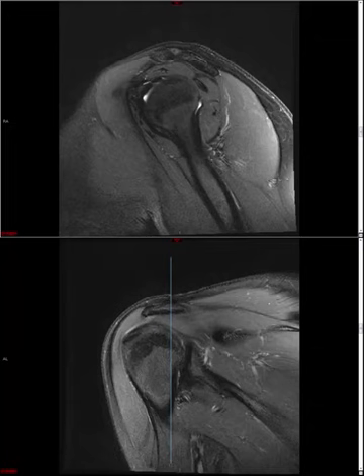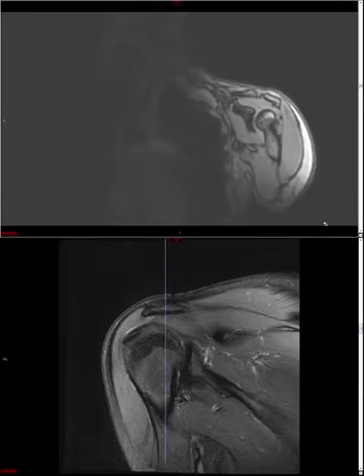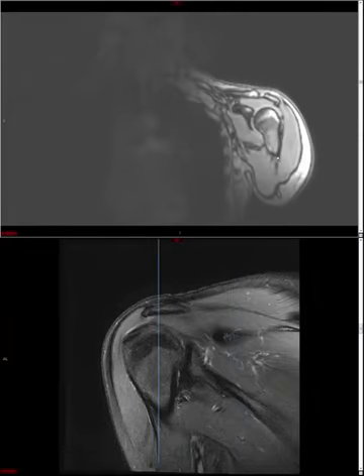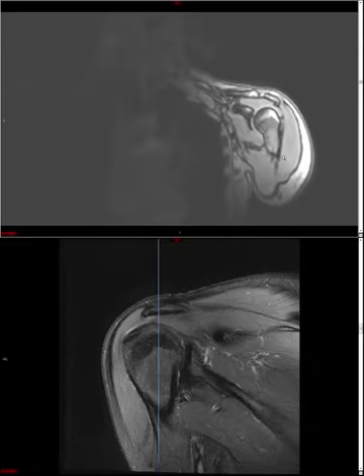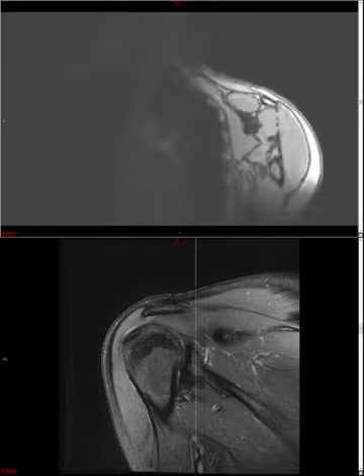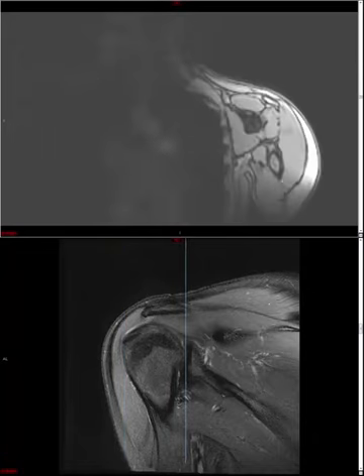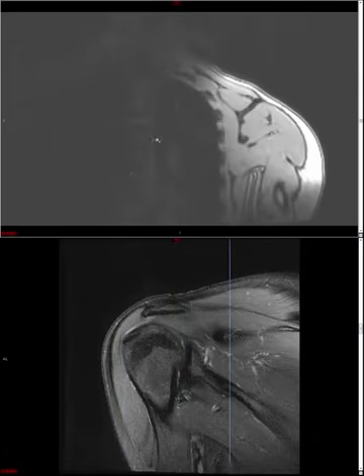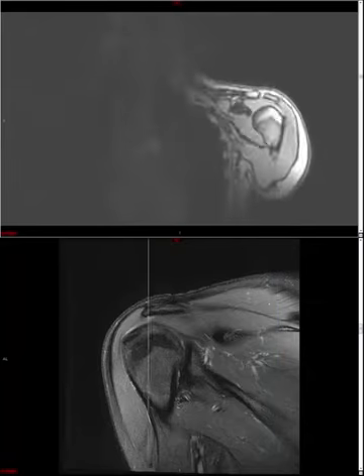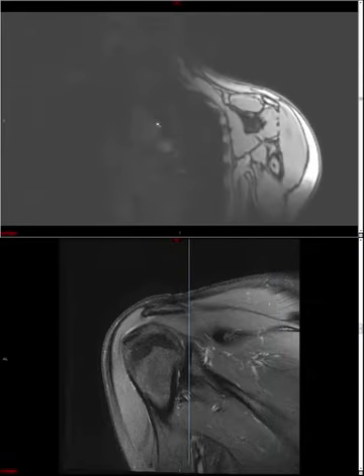We're going to begin with a comment about the localizer image. Unlike the knee, the localizer — which the tech does to ensure the patient is positioned properly within the scanner — actually shows you a lot of anatomy that isn't shown on subsequent diagnostic sequences. It's important to spend a few seconds reviewing the localizer images, ensuring there's not a huge lung cancer or spine lesion hiding there that we would be responsible for reporting.